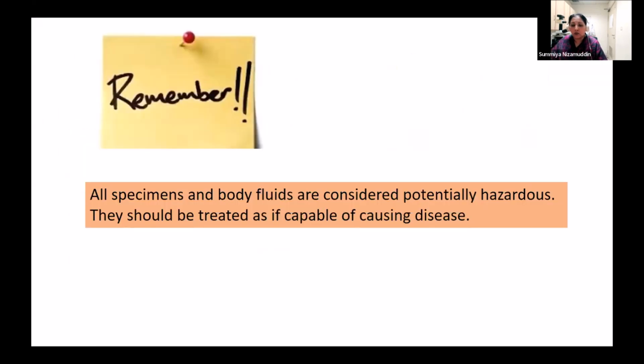One thing that we have to absolutely remember is that all specimens and all body fluids are potentially hazardous. You might not actually know what infection the patient might be suffering from at that point in time. So you have to be absolutely sure that these specimens and body fluids are handled properly with the appropriate PPE, and that these samples do not come in direct contact with your skin surface.